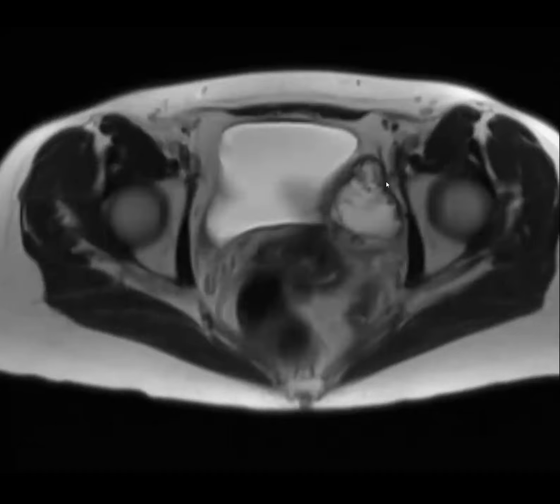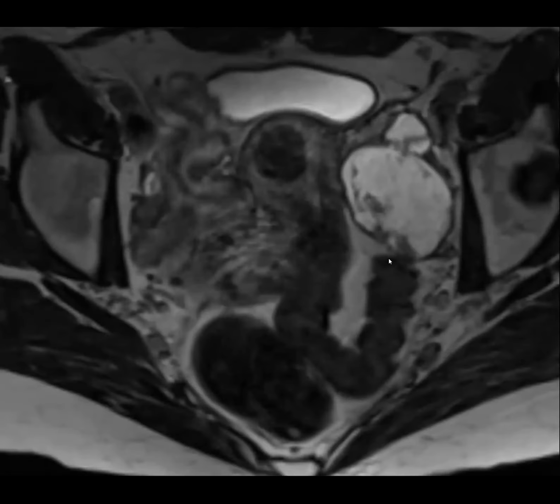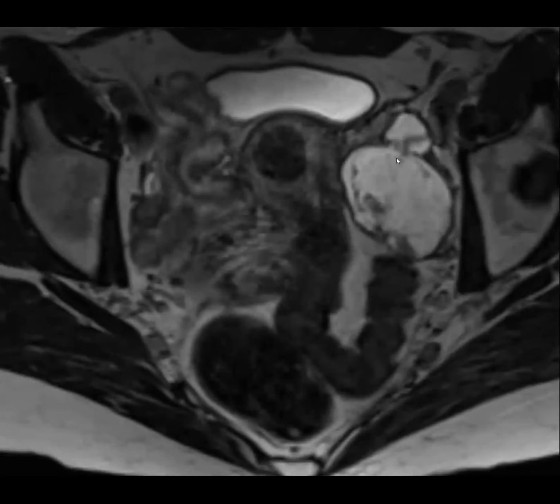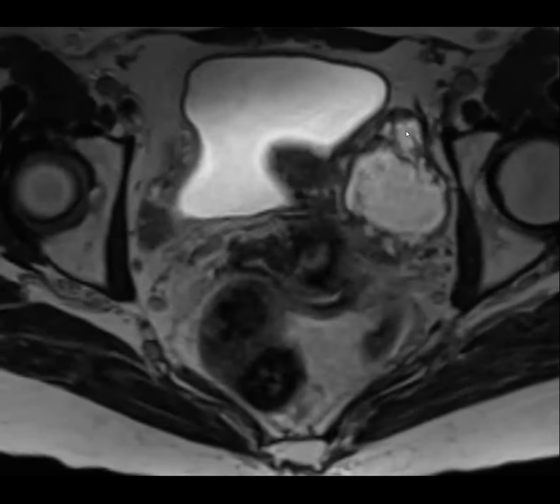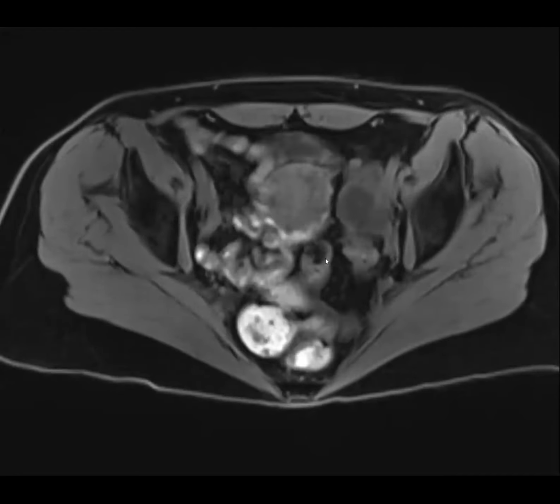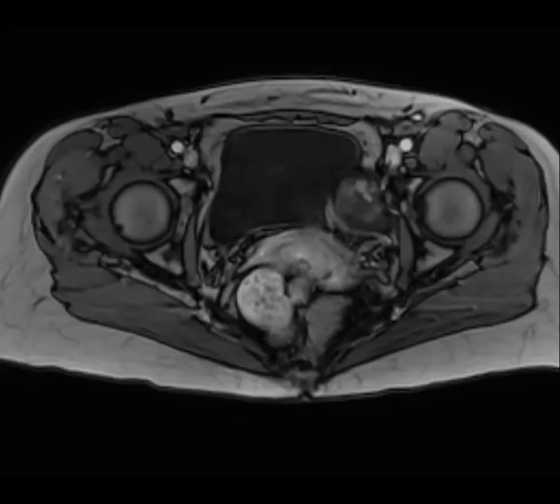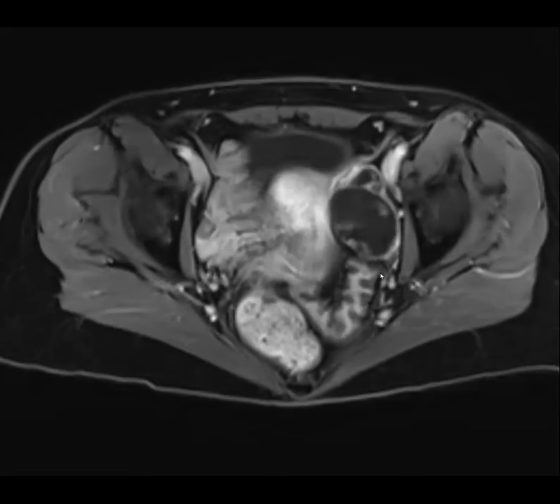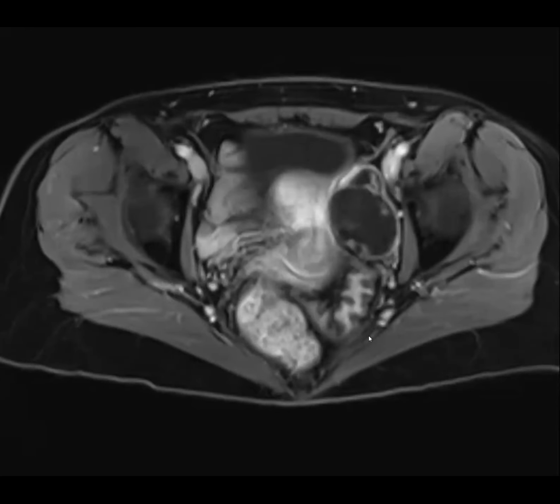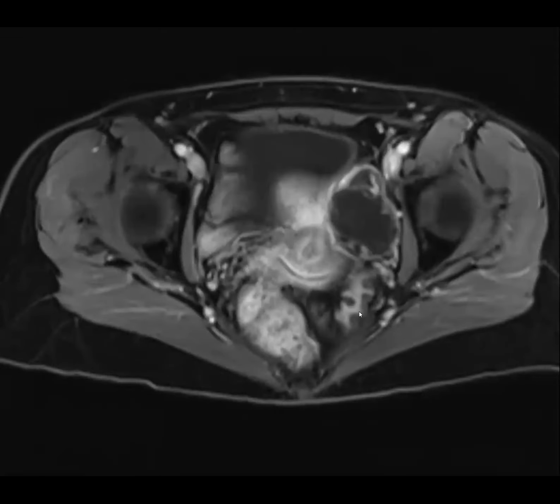And here it is. I'll show you several, high res. So there it is. Very T2 bright, very weird blobby appearance. Some septations, pre-contrast, not a lot of T1 hyperintensity. It's not an endometrioma. So like a myxoid or a mucin thing. Some weird septa. Enhancing nodular septations.